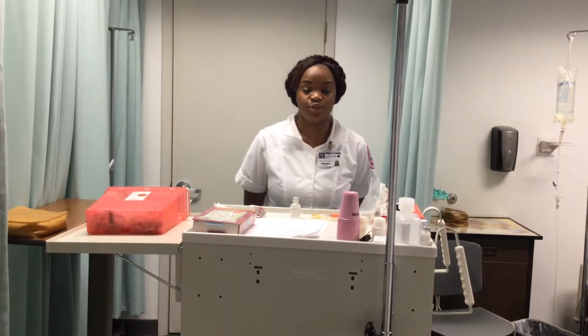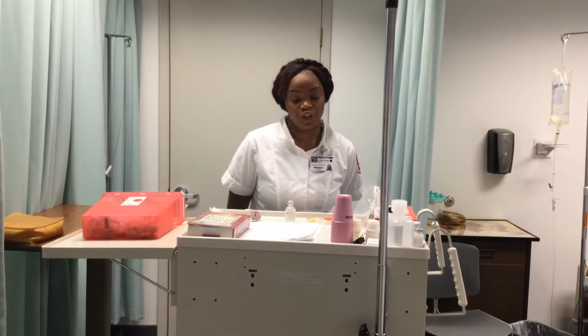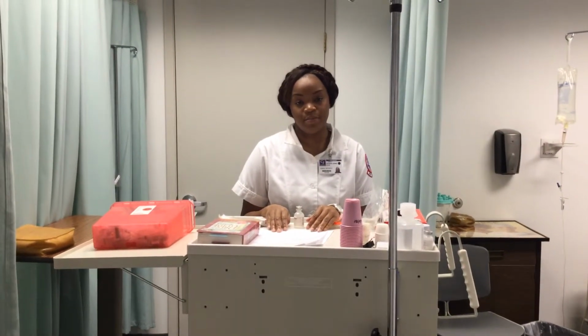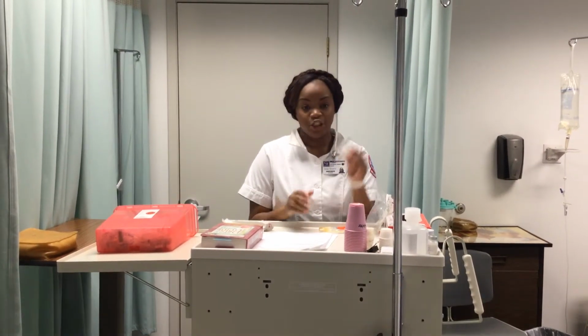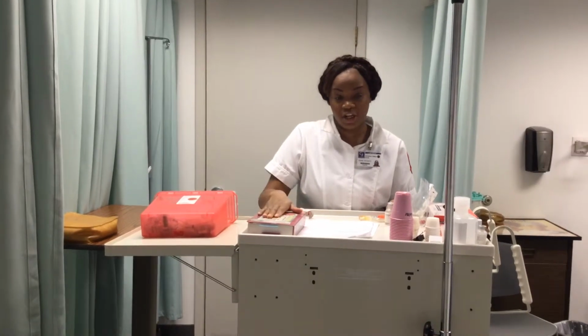My name is Latasha Jones. I'm a student with the College of Central Florida, and I'm going to perform an IV administration. I have my doctor's orders, and it states to administer gentamicin 80 milligrams IV. I have my gentamicin medication. I have my drug book here. I looked up the medication.